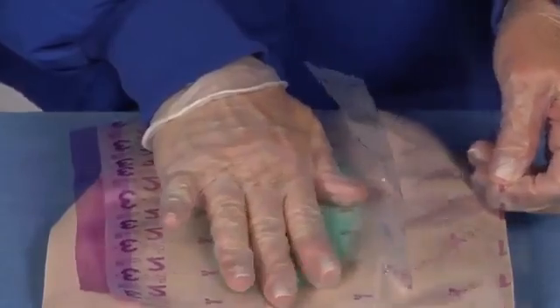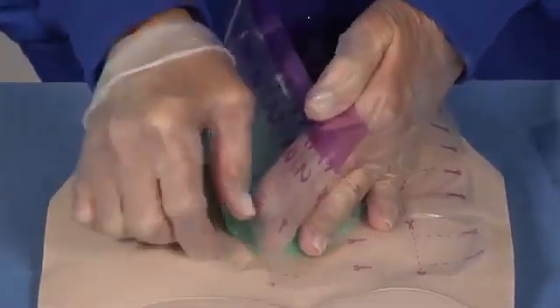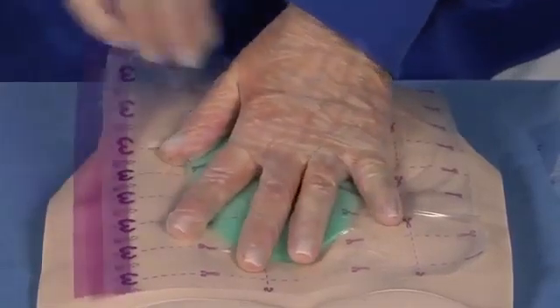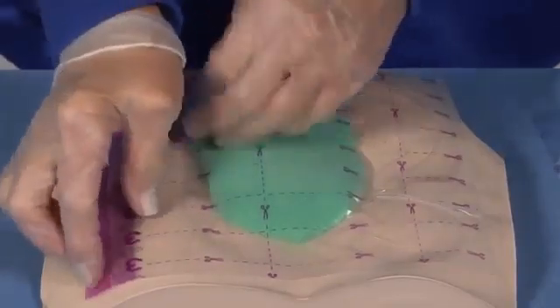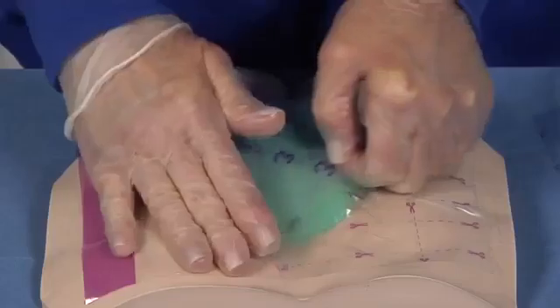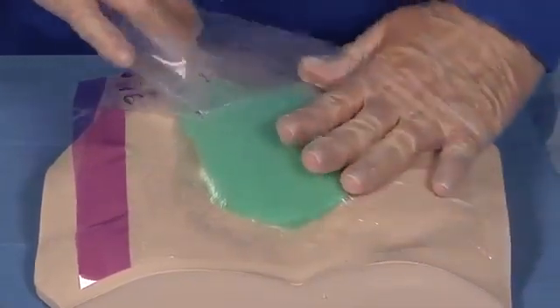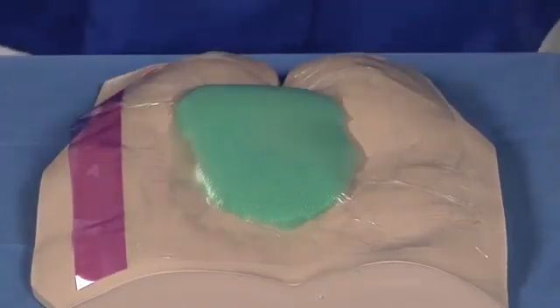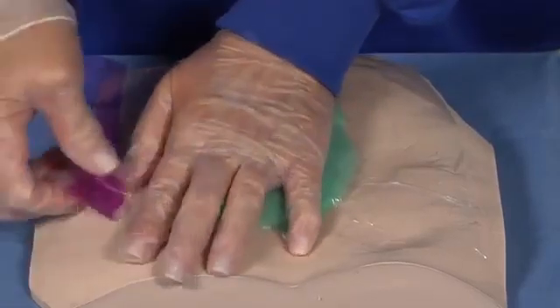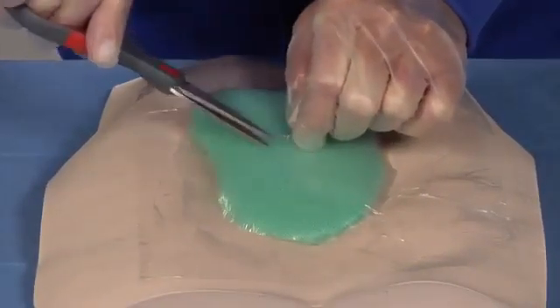Finally, apply the transparent dressing, leaving at least 2 to 3 cm beyond the skin edge. Choose a port dressing site and cut a quarter-size opening in the transparent film.